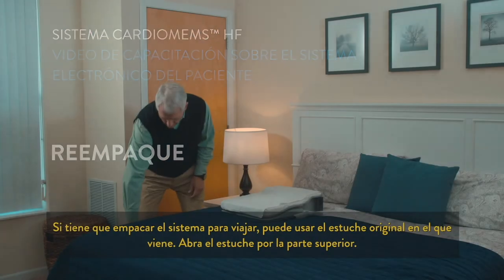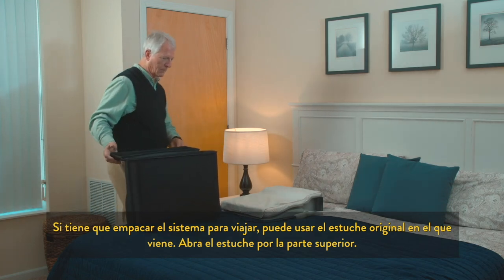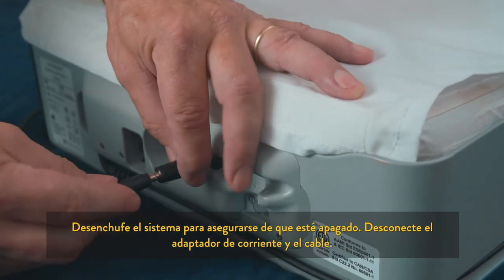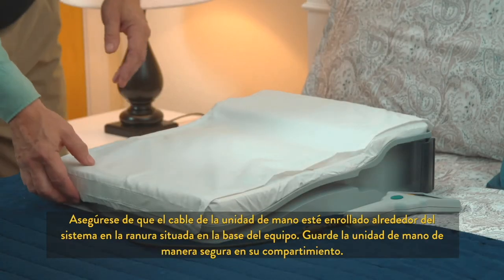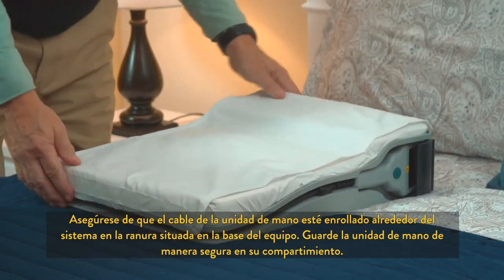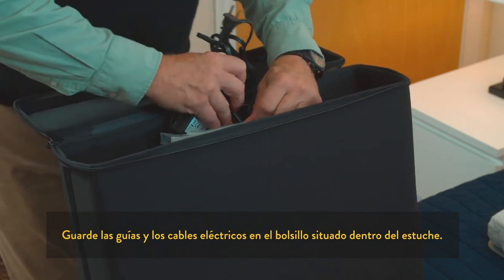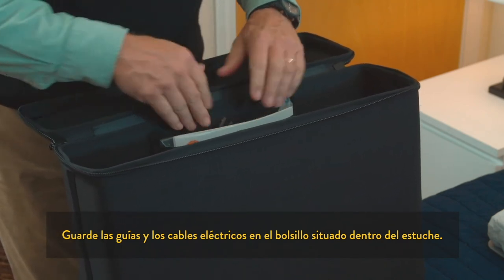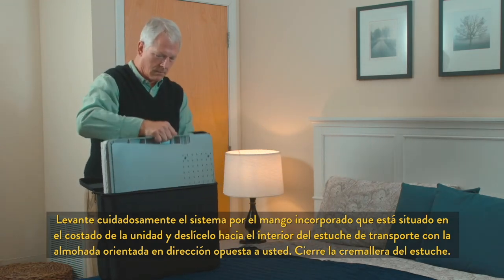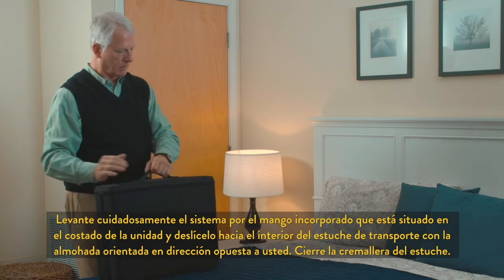If you need to pack up your system for travel, you may use the original case that it arrived in. Open the carrying case from the top. Ensure that the system power is off by unplugging it. Detach the power adapter and cord. Ensure that the cable for the handheld unit wraps around the system using the slot located at the base of the unit. Secure the handheld unit in the storage cradle. Slide the guides and power cords into the pocket inside the travel case. Gently lift the system by the built-in handle and slide it securely into the carrying case with the pillow facing away from you. Zip the case closed.